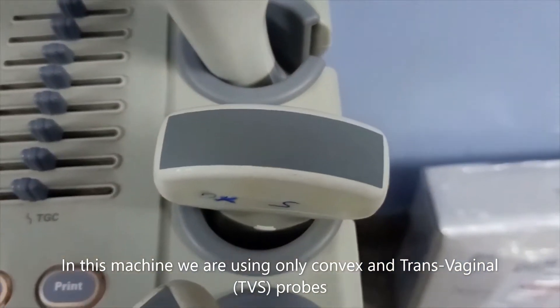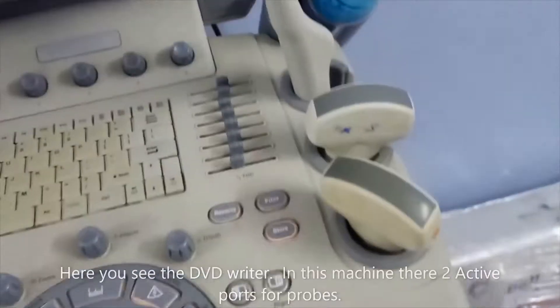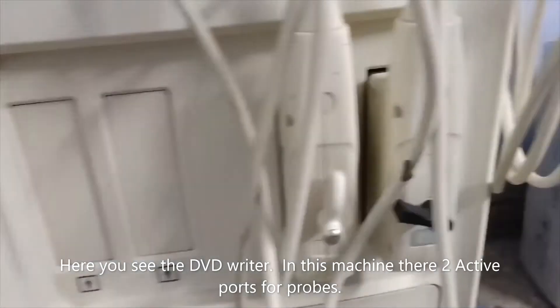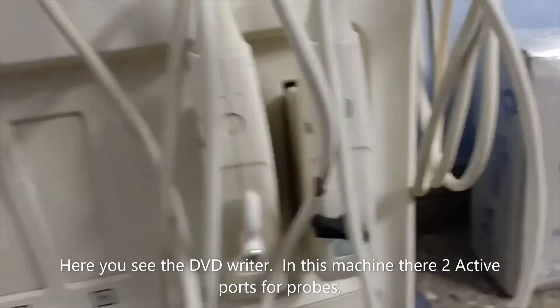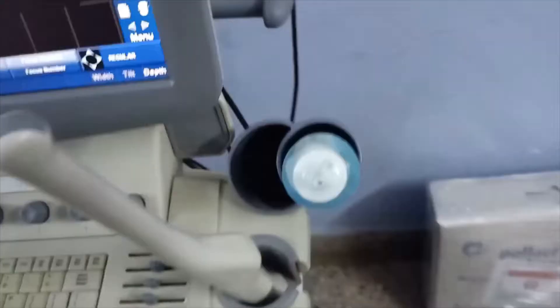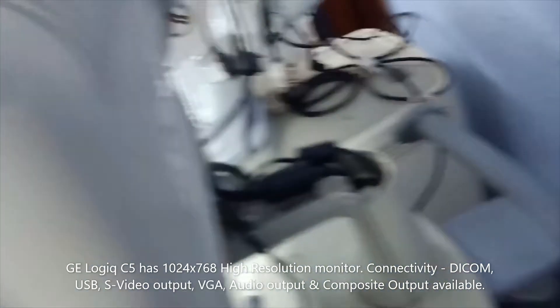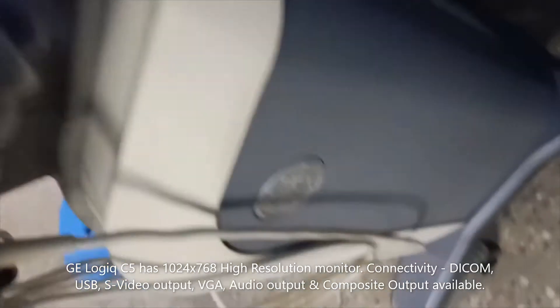We are looking at probe availability — we are using two probes: a convex and a TVS probe. Here you can see the DVD writer, and below there is a probe holder, but in that place we need to install a black-and-white printer. Two active probes are installed using these encoder-type or multi-function switches.